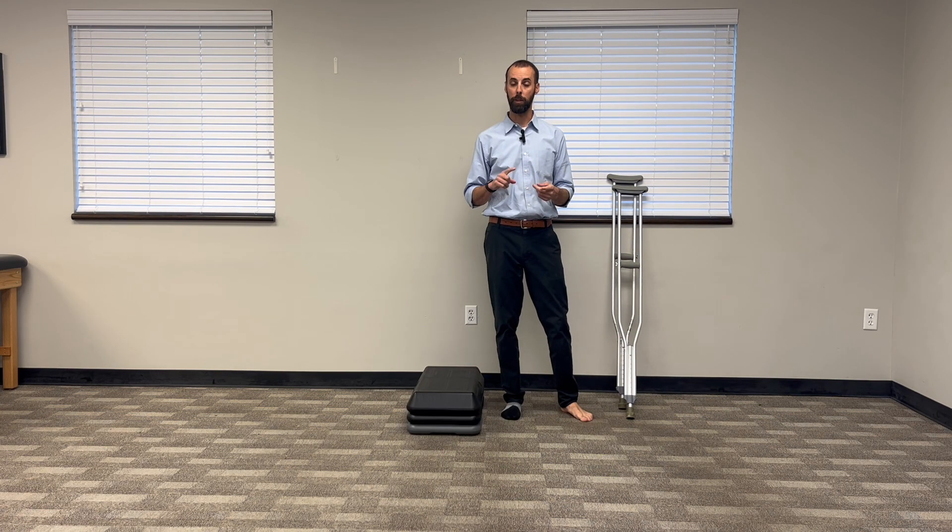My name is Rob Dranning. I'm a physical therapist. I'm going to show you right now how to use crutches on steps and do it safely and comfortably, so you can get everywhere you need to go in your house and not be afraid to go up and down a curb when you're out in the community.